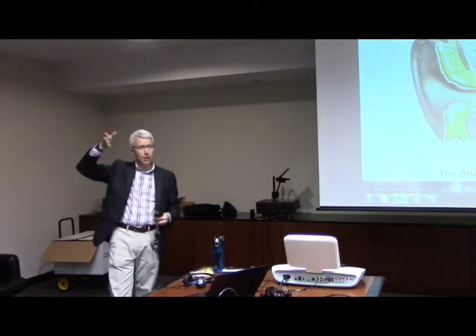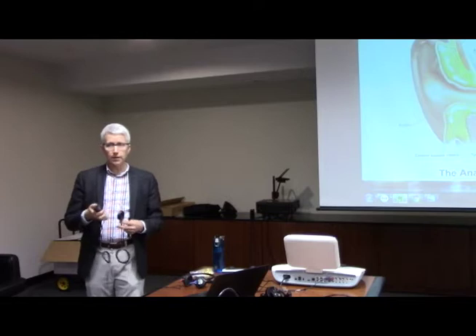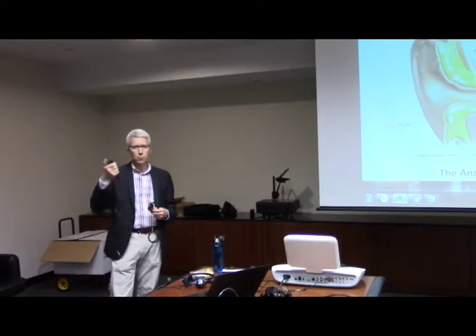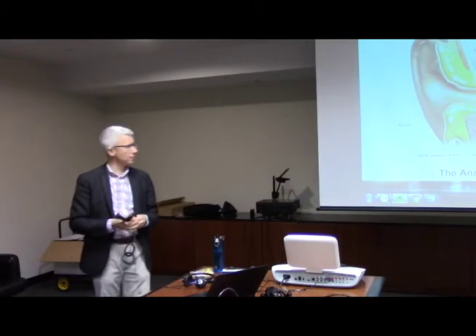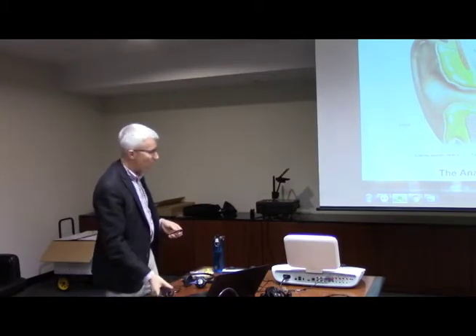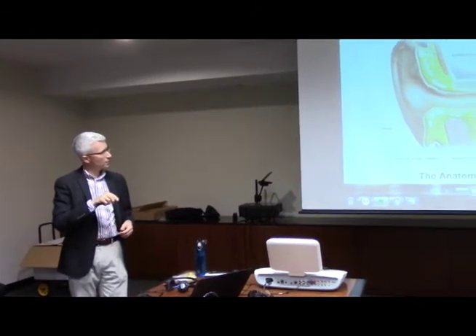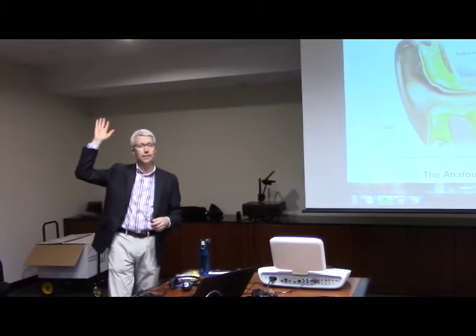Some places will say raise your hand. There are some automated audiometers where they just hit start, and then as the patient hears the tone, they push the button, and that tells the audiometer they heard it, and then the audiometer goes on and does the rest of it. So every time they hear it, that means the sound was picked up here, went through here, did all its stuff in here, went through there, and went up to the nerve and up to the brain, and the patient was able to say, yes, I hear that.